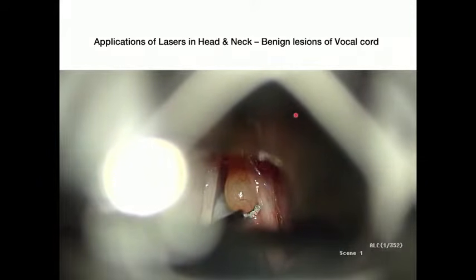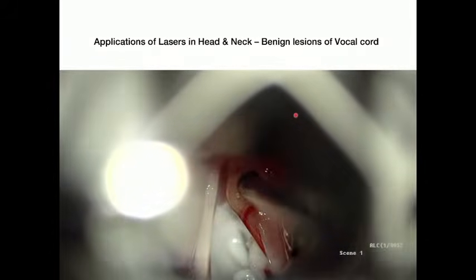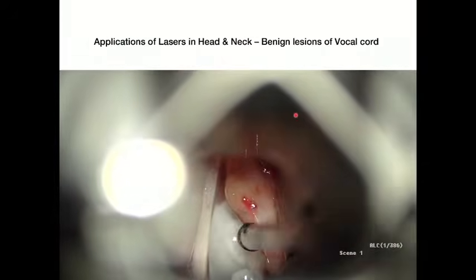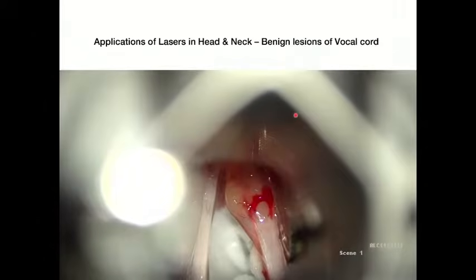It heals with a healthy slough formation. In about a month's time, it's nicely mucosalized, and they do really well. When you're dealing with a benign cyst like that, you need to preserve maximum mucosa. At the same time, we need to remove it in its entirety.